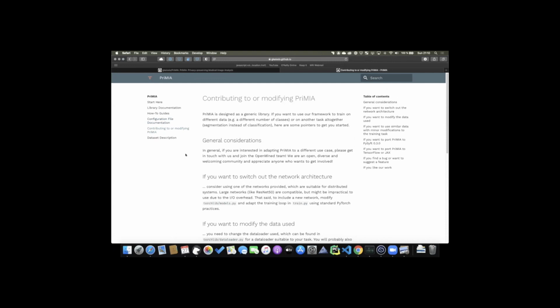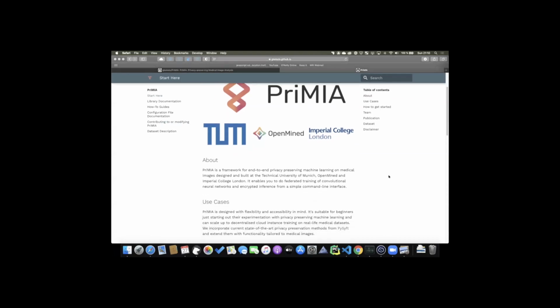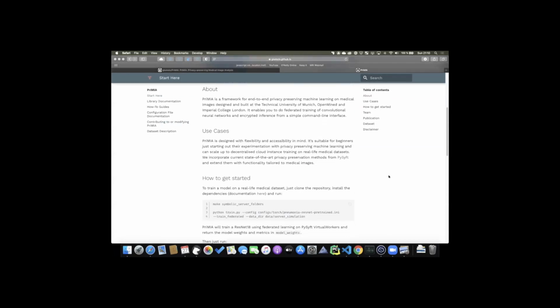So let me perhaps get started and give you a brief overview of what PriMIA does. PriMIA is a library for federated learning, securely aggregated federated learning, and for secure inference.